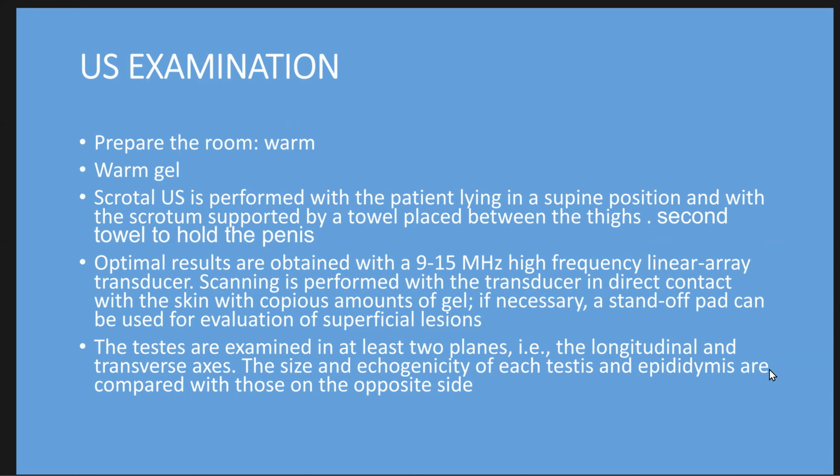Optimal results are obtained with a 9 to 15 megahertz high frequency linear array transducer, and scanning performed with the transducer in direct contact with the skin with a copious amount of gel. If necessary, a stand-off pad can be used for evaluation of superficial lesions.